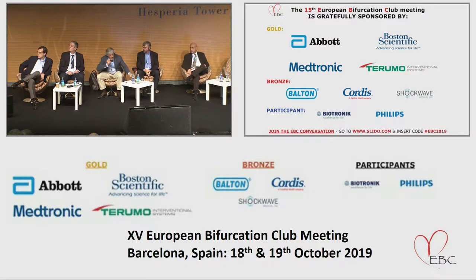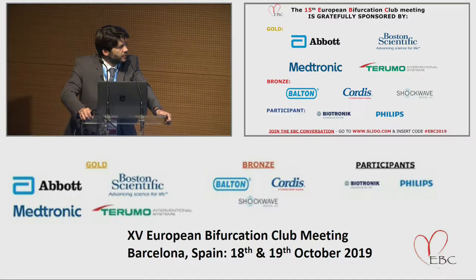First, that's a common situation, a very difficult one, and we don't have any consensus or even guidance for that. So in our hands and in our cath lab, we're doing a little like you, maybe not using the 90%, but maybe going up to 80%, not to be too aggressive. But I think that's a very good approach, and we could face the same issues, for example, in a LAD diagonal bifurcation. Sometimes the LAD is massively diseased, and identifying the correct landing zones and the correct reference area is really challenging.